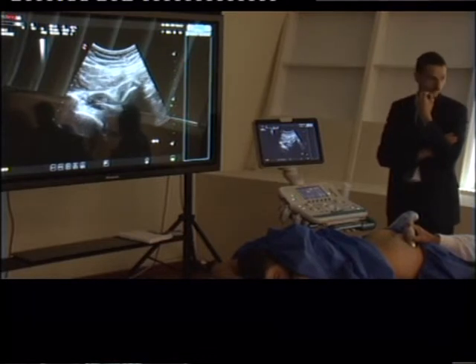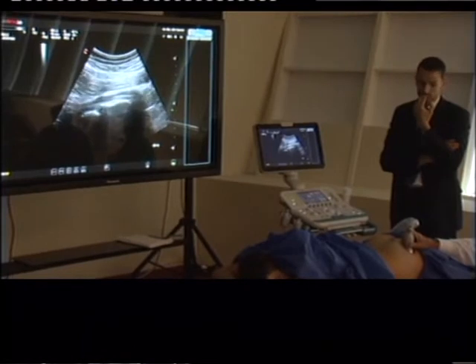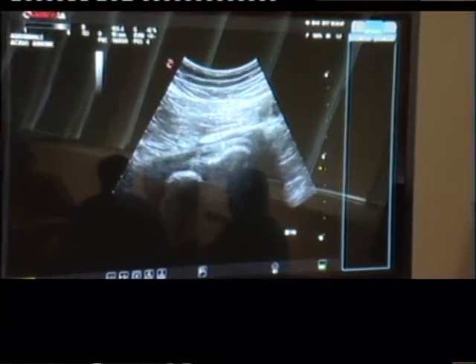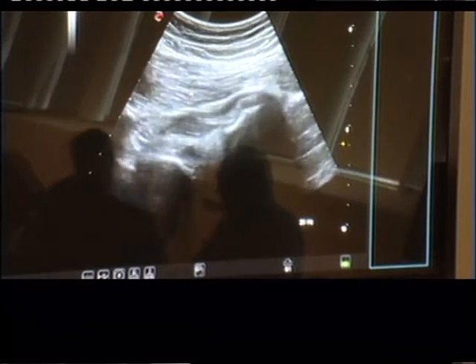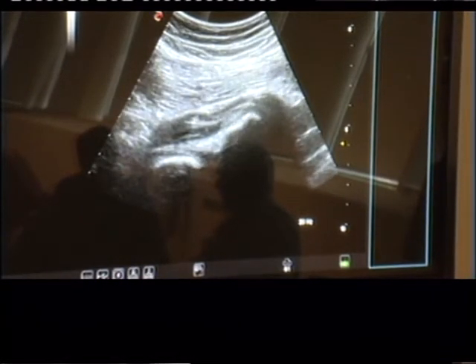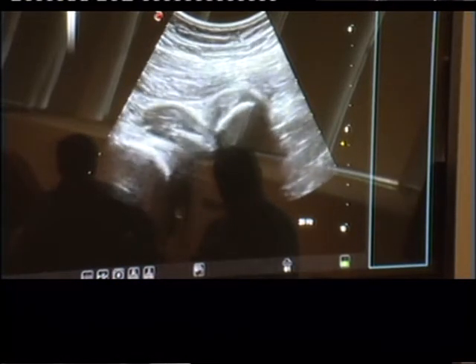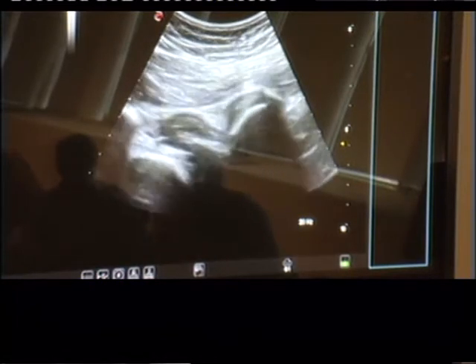So, dobbiamo vedere quanto si muove la sonda. Look at the probe. Obturator internus, hamstring. Just a bit. Muove pochissimo. Not even a centimeter. Just a little bit. So watch. So this is conjoint tendon of hamstring here.